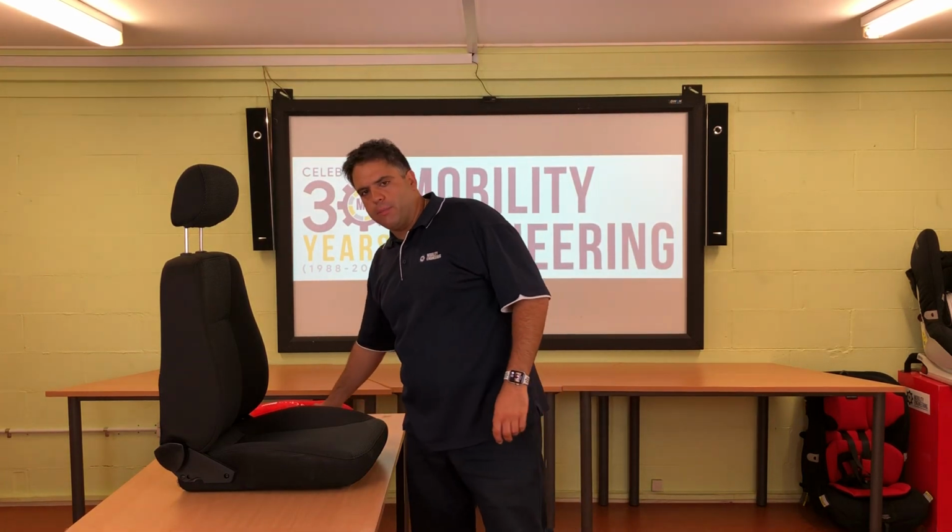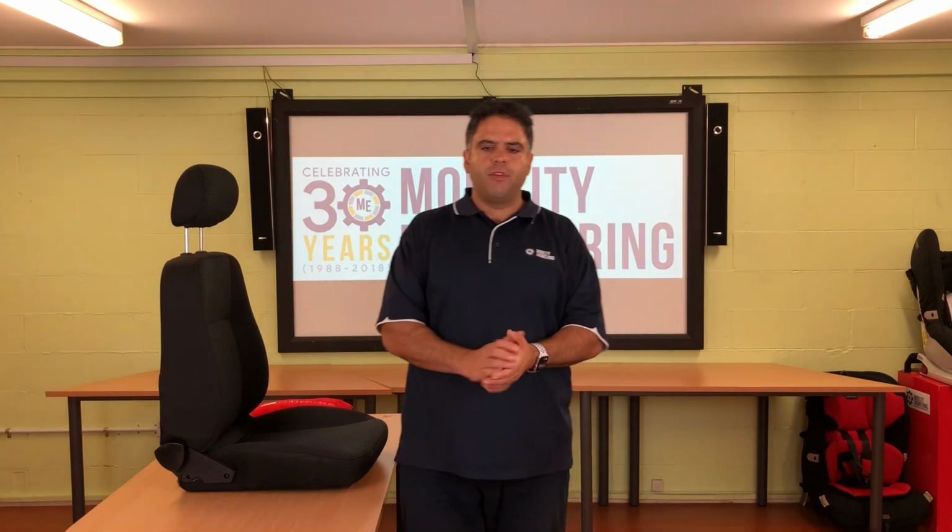So there's a whole bunch of other background information to this case. Basically, we have an occupant who's in a wheelchair who is tilting back while in transport, and they tilt back for comfort and other reasons that they are required to tilt back for their condition. And there have been questions raised by drivers or other people to say, oh, we don't want to tilt them back because we think it's dangerous or illegal, or there's something wrong with tilting back in transport. So what's the answer? What do we need to do?